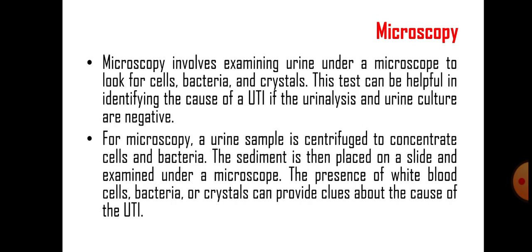One should be capable of working with a microscope, though it is a very fundamental instrument in a biological laboratory. A candidate or a life science student should have all the knowledge about the microscope, so that he can interpret the results in a better way when compared to a normal biochemist.